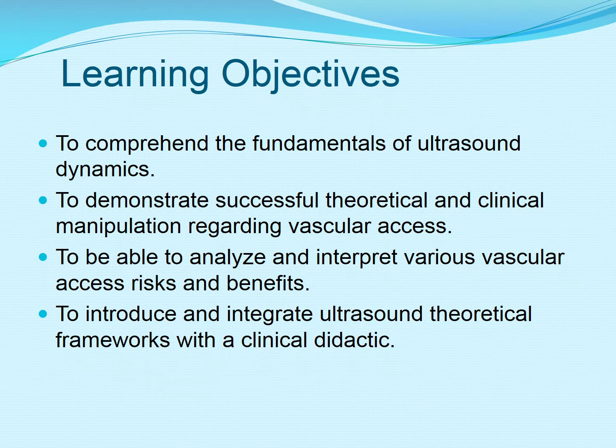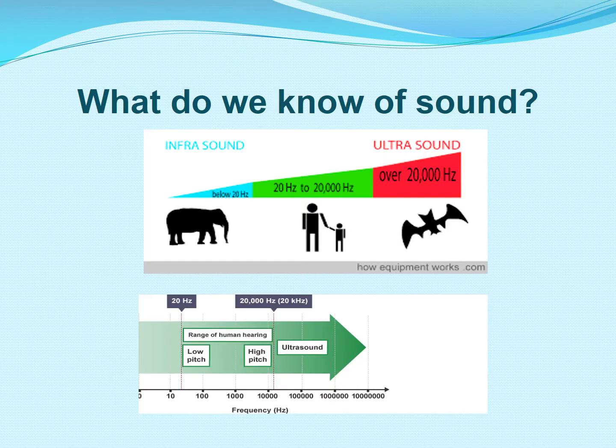Learning objectives: to comprehend the fundamentals of ultrasound dynamics, to demonstrate successful theoretical and clinical manipulation regarding vascular access, to be able to analyze and interpret various vascular access risks and benefits, to introduce and integrate ultrasound theoretical frameworks with a clinical didactic. So what do we know of sound?